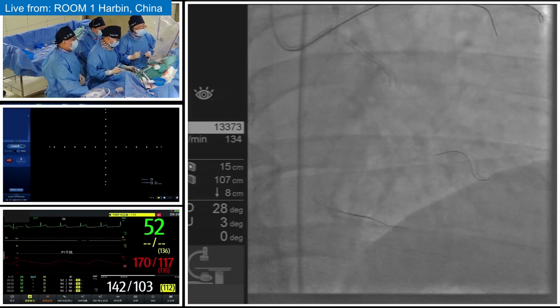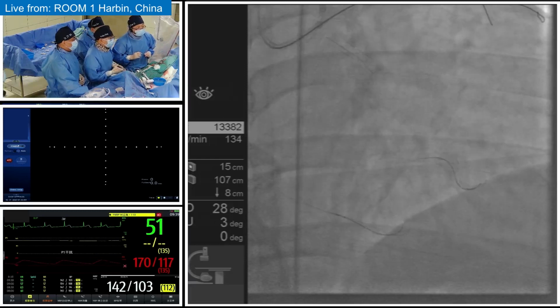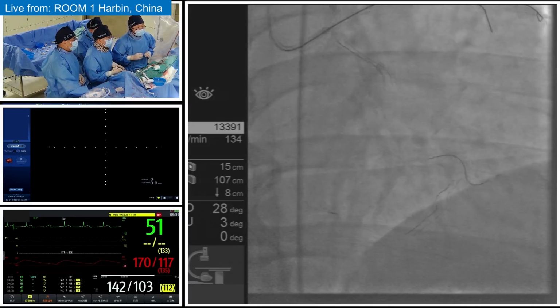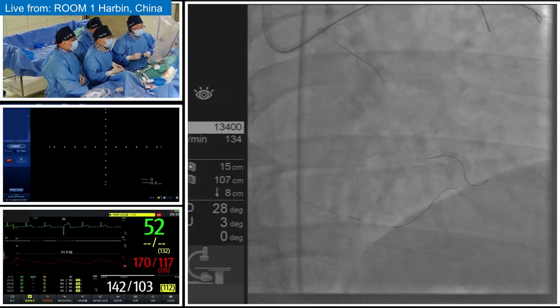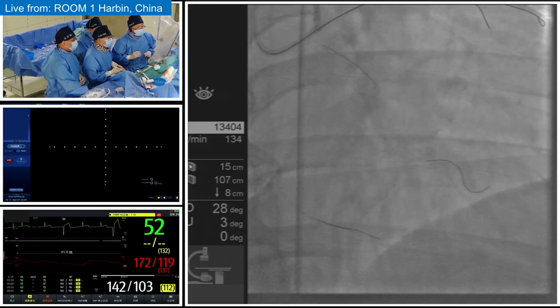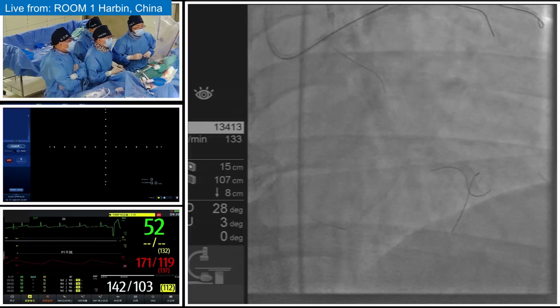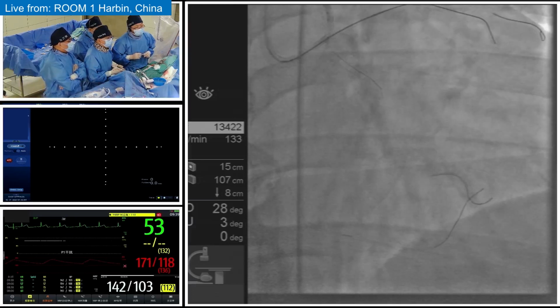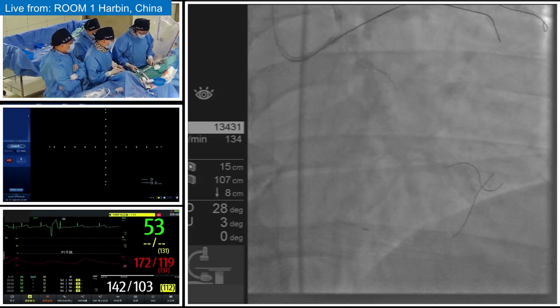Okay, okay. Yes, one a bit further. Okay, now. Yes, I think this one is a potential one.